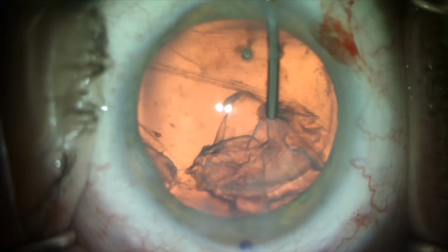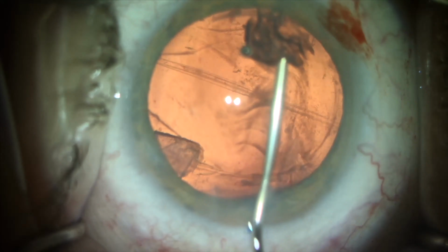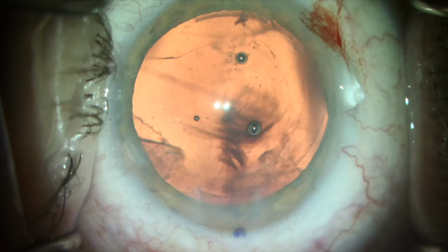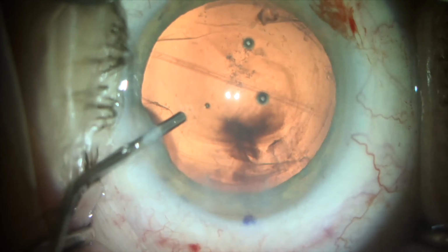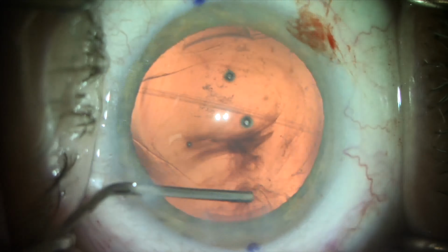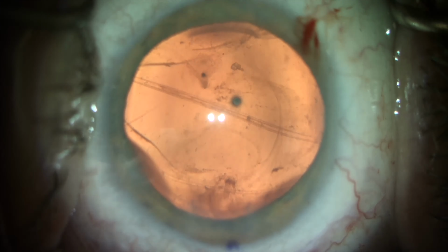Anterior vitrectomy using irrigation, aspiration, cut settings might create the same types of complications that irrigation and aspiration alone might create. So we're using generous amounts of viscoelastic, but it ends up working very nicely, and we end up being able to remove all of the cortex in a very safe and controlled manner without putting undue stress or stretch on the capsular bag, because we do not want to extend the capsular opening. We want to preserve the capsular bag complex that we currently have and not make it worse. But at the same time, we want to make sure we can remove the cortex in its entirety, which we're able to do using this technique.